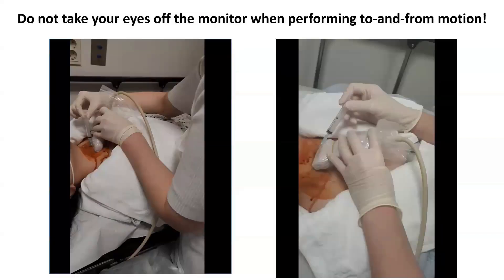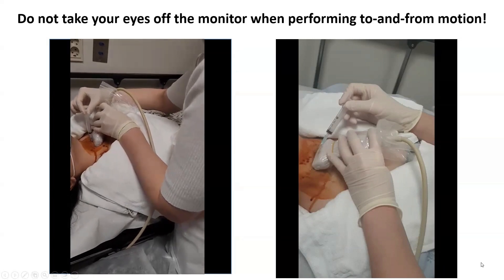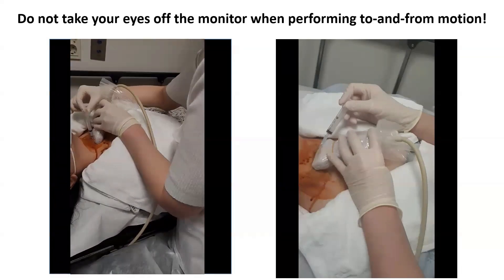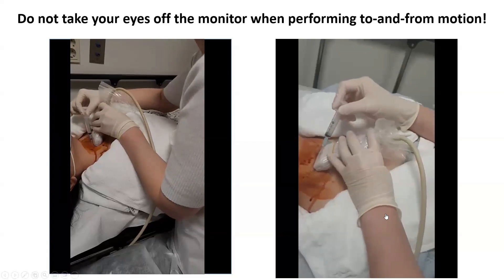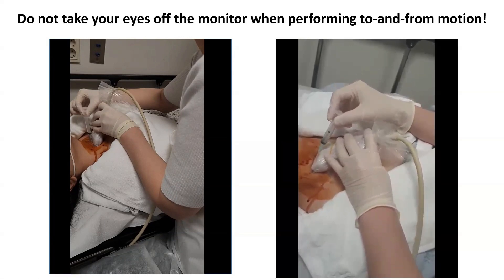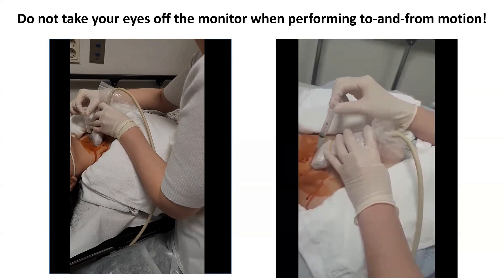Let's see a video of FNA with both wrists and arms fixed.